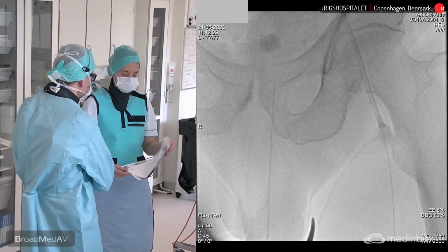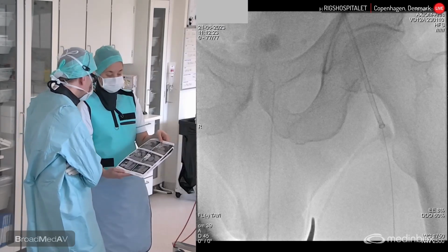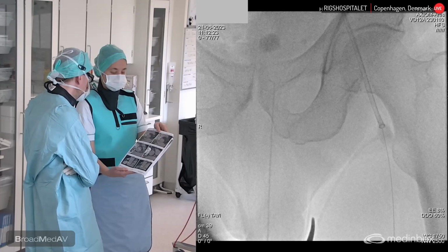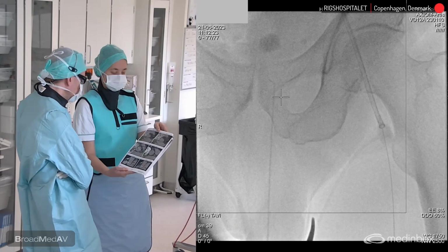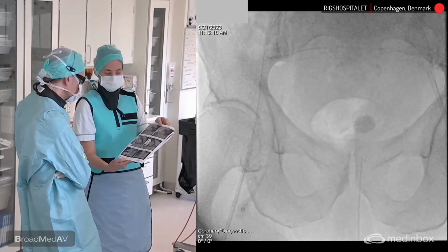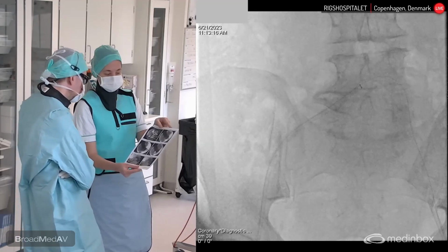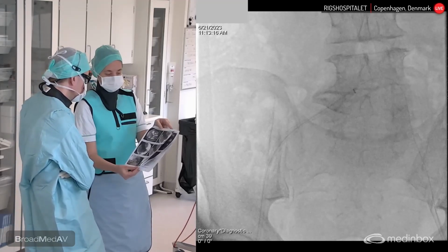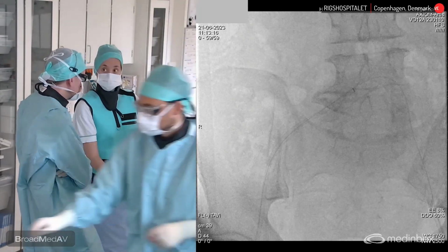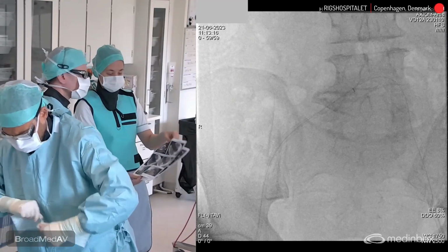On the anatomy, he has a very calcified tricuspid aortic stenosis. Just to give you some idea about the sizing, he has a perimeter derived mean diameter of 25.5. Tricuspid, as said, coronary heights are all above 12 millimeters, so no concern for that. The aortic root angulation is kind of neutral, 45 or 50 degrees. Actually, there's a little touch of horizontality in it.